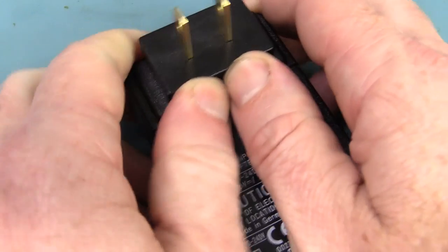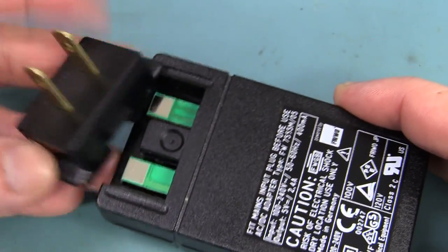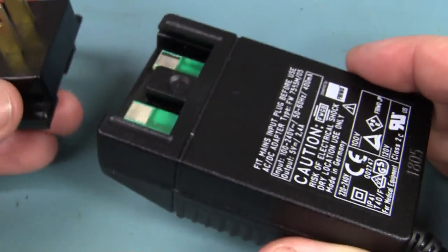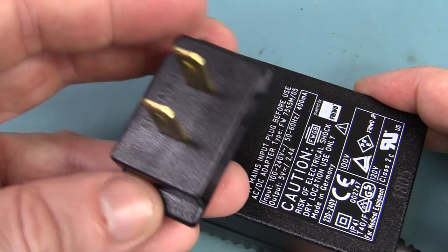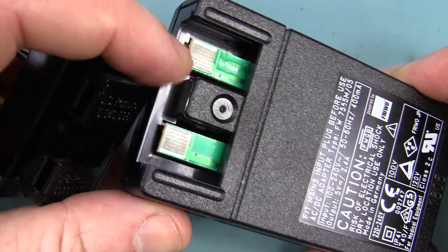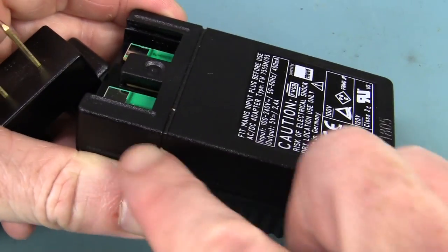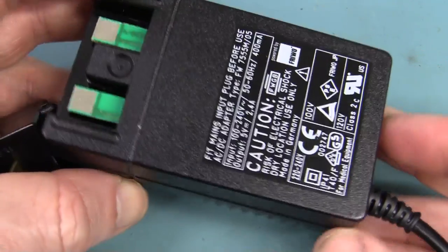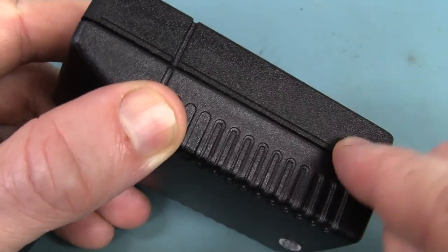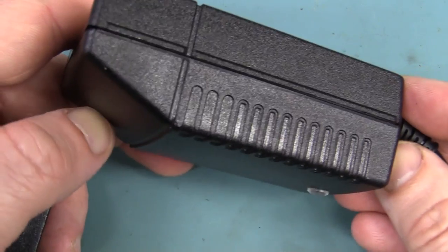I do like these plug packs with the plug-in replaceable plugs — usually they're not that hard to get off. This isn't particular to these medical ones. A lot of plug packs these days supplied with consumer products now have these plug-in replaceable plugs. So instead of giving you five plug packs or different leads with different plugs, they just give you these little adapters and include all five in the package. You can see the pads on the PCB down in there — they just make direct contact. So there's probably just one single PCB inside this entire thing. Let's crack it open and have a look. Unfortunately this looks like it's ultrasonically welded, so I may have to get the Dremel out. This one doesn't seem to budge at all, so — Dremel time.